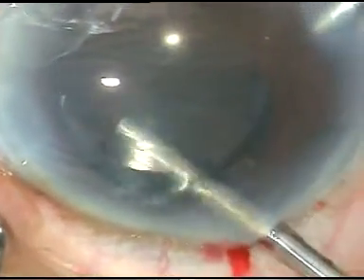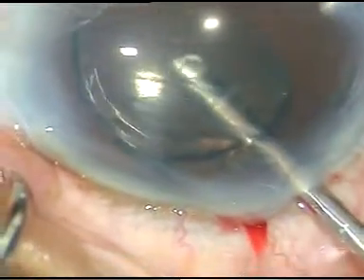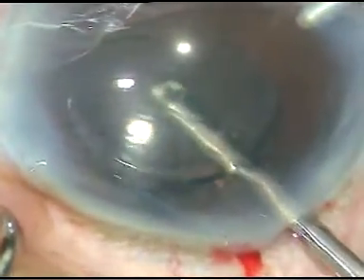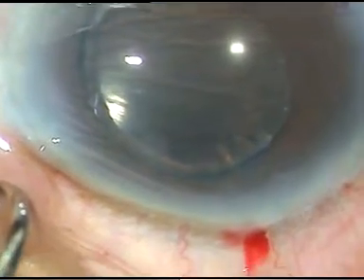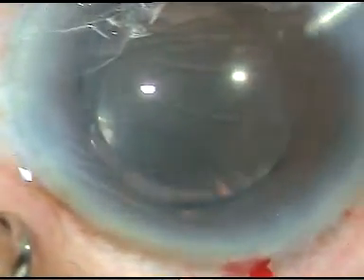I can see that a portion of the posterior capsule is intact there, and I'm not trying to cut it, because if I try to cut it, some epinuclear lens matter will go into the vitreous cavity.